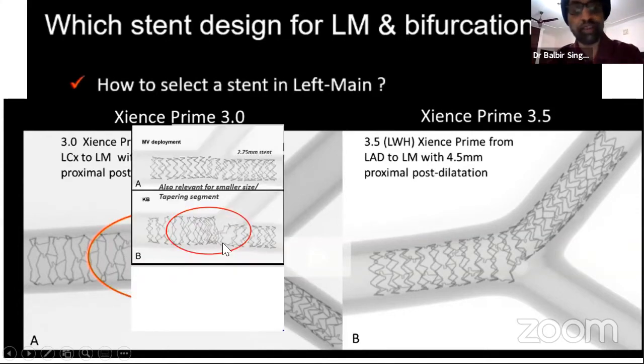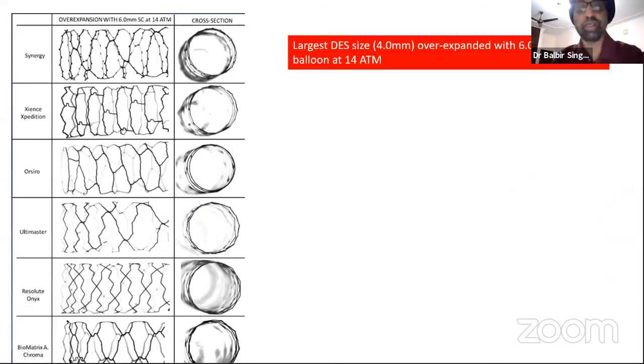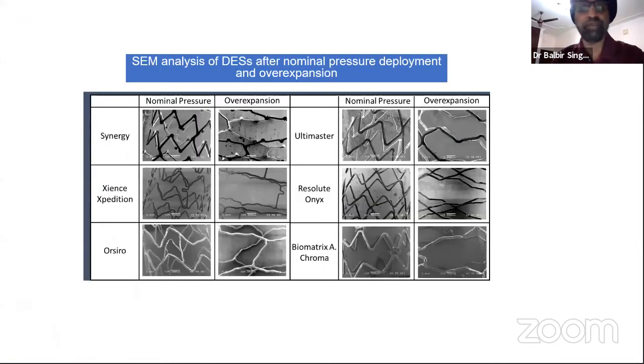So what will happen at the ostium of the circumflex? Why is the ostium of the circumflex so bad? Because you deform the stent when it is taking that bend at the ostium. So this part of the stent is overexpanded, the stent is deformed. So this part of the vessel is barren, it will not have any stent, and this part has two crowded cells. So this is how these properties are important and we must know them.